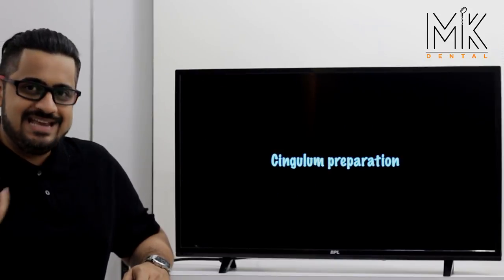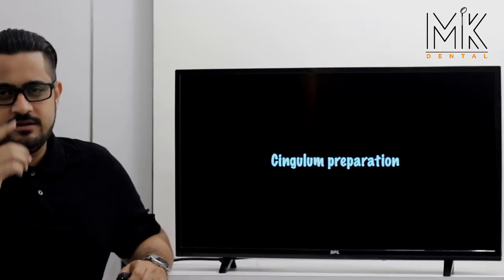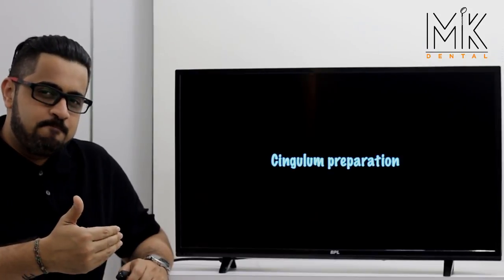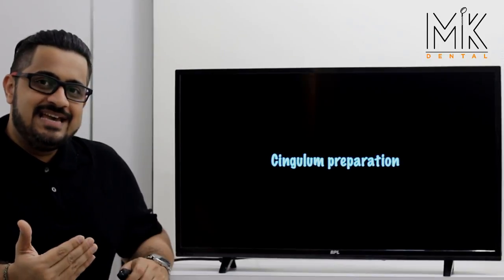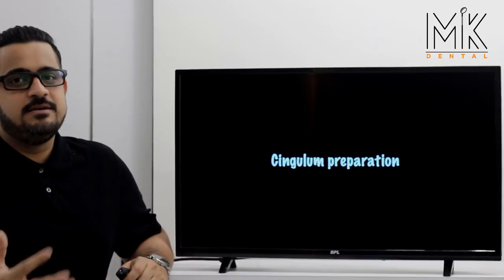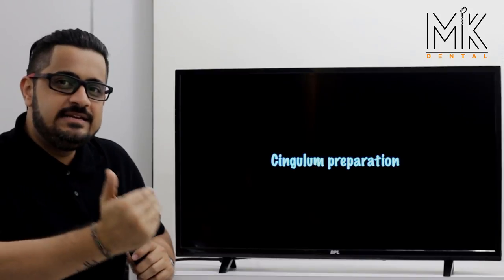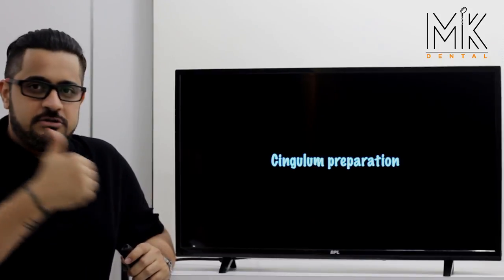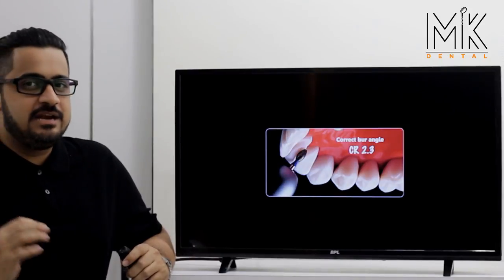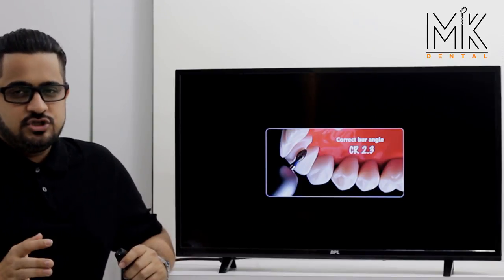Once the incisal edge is reduced, the last surface to reduce is the lingual concavity — the portion immediately above the cingulum. Here we use the flame-shaped or American football burr. A common error is under-reducing this area, or over-reducing the incisal edge making it extremely thin. The correct technique: keep the widest area of the burr seated into the deepest concavity of the tooth and move it horizontally all the way through. This uniformly reduces the concavity without under-reducing in critical areas or over-reducing toward the incisal edge.